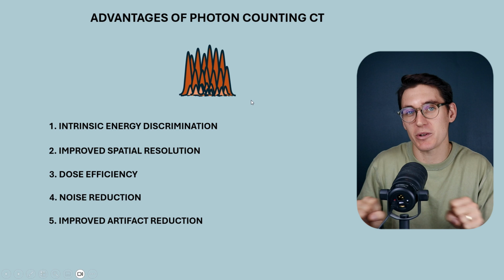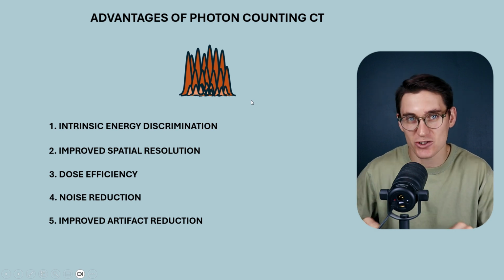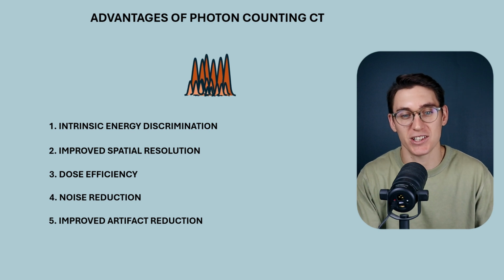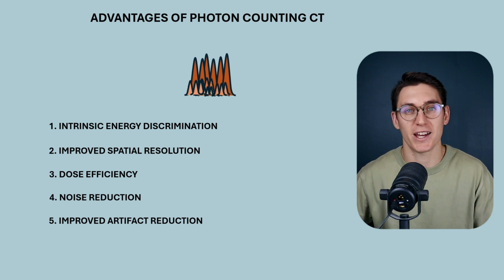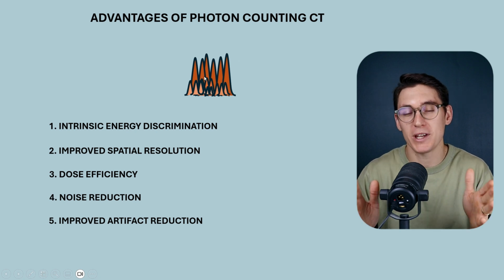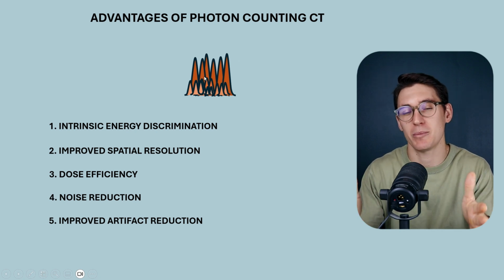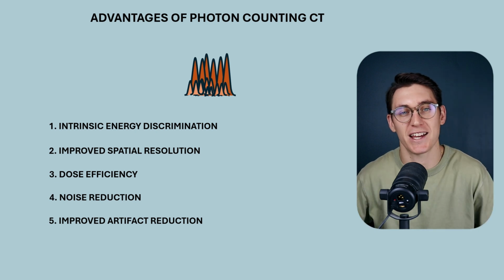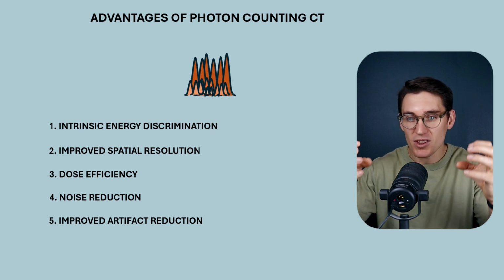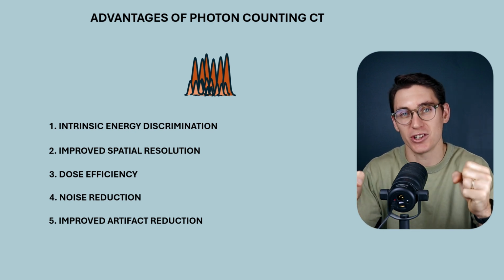What we can do, because we're able to separate the X-ray energies, discriminate between X-ray energies, is we can remove the higher X-ray energies and we can amplify those lower X-ray energy photons and compensate directly at the source for beam hardening. We can say this area had a lot of beam hardening. Let's remove those higher X-ray energy photons that are going to cause algorithms to falsely calculate the Hounsfield units as lower values.